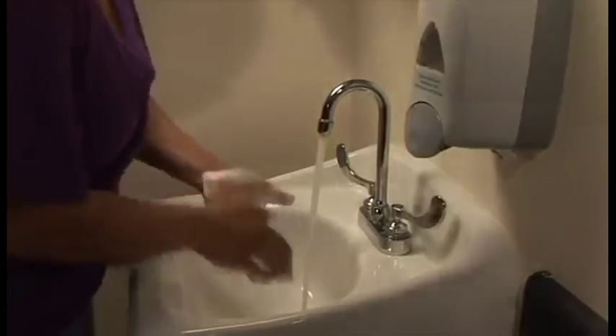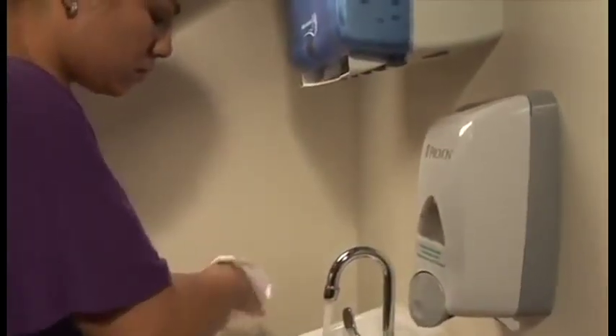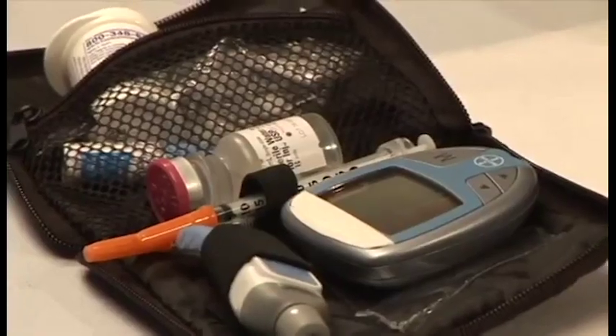Wash your hands thoroughly with soap and water. Dry your hands with a clean towel or paper towel. Place a syringe and other materials on a clean paper towel.